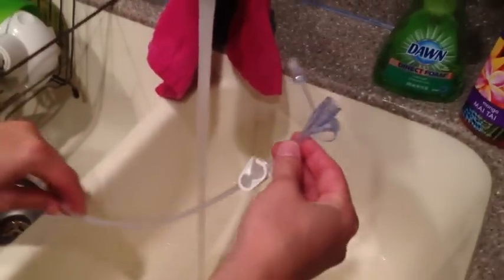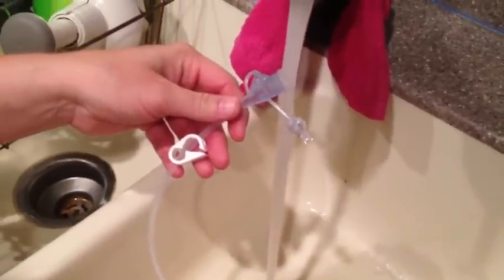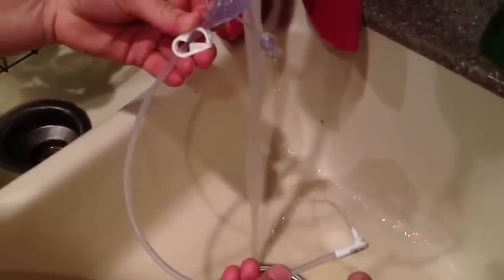Once that's ready, you're going to have the tube that connects to the stomach. Make sure the clamp is open, make sure the small port is closed, and just run water into the tip. You'll see the water come out of the other end. Then clamp it and shut it — that will be ready to go as well.